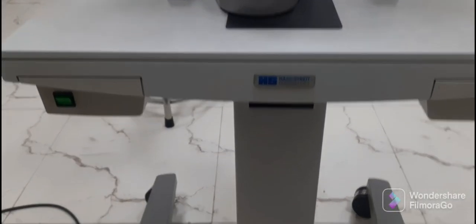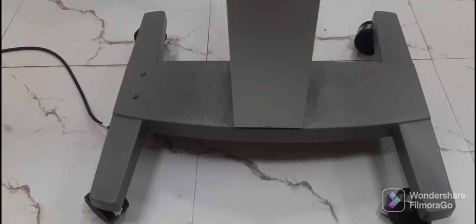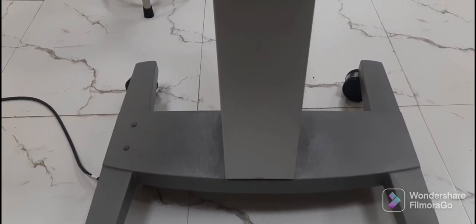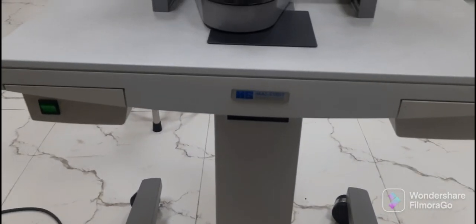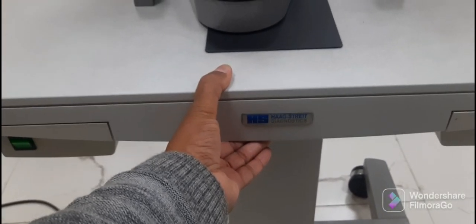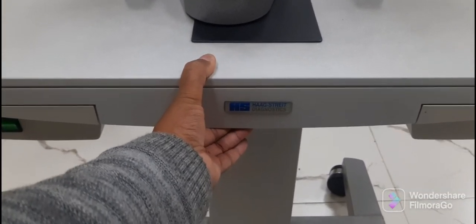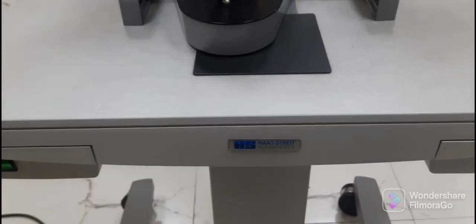Welcome to the first part of the video series on slit lamp. In this video, we will cover the parts of the slit lamp. This is the motorized table on which the slit lamp is mounted. In the middle of the table, there is a button used to move the slit lamp up and down according to the height of the patient, as you can see in the video.